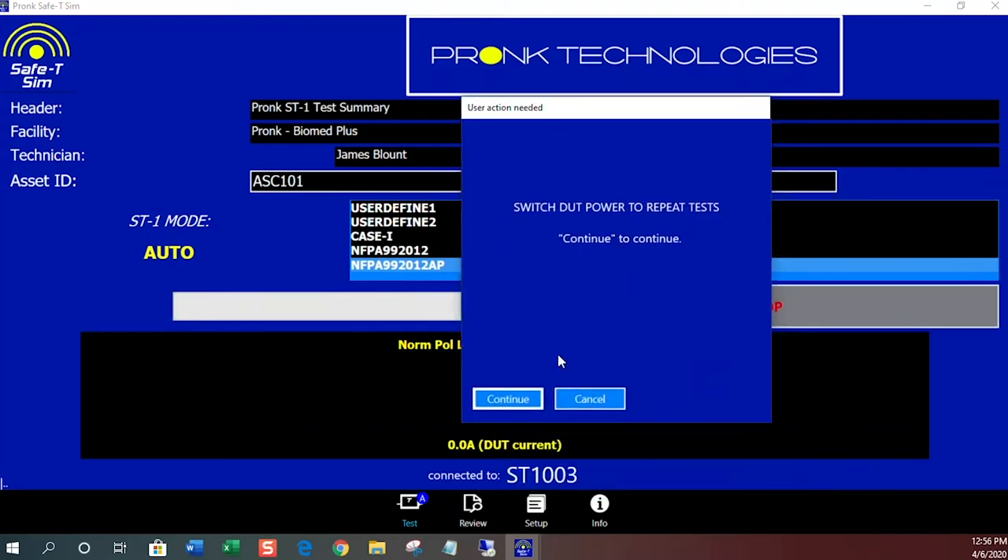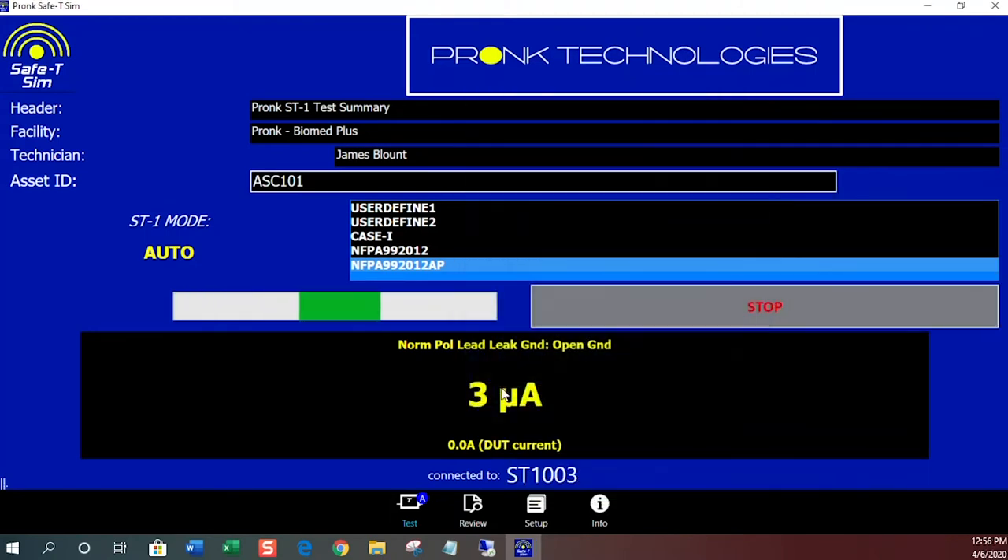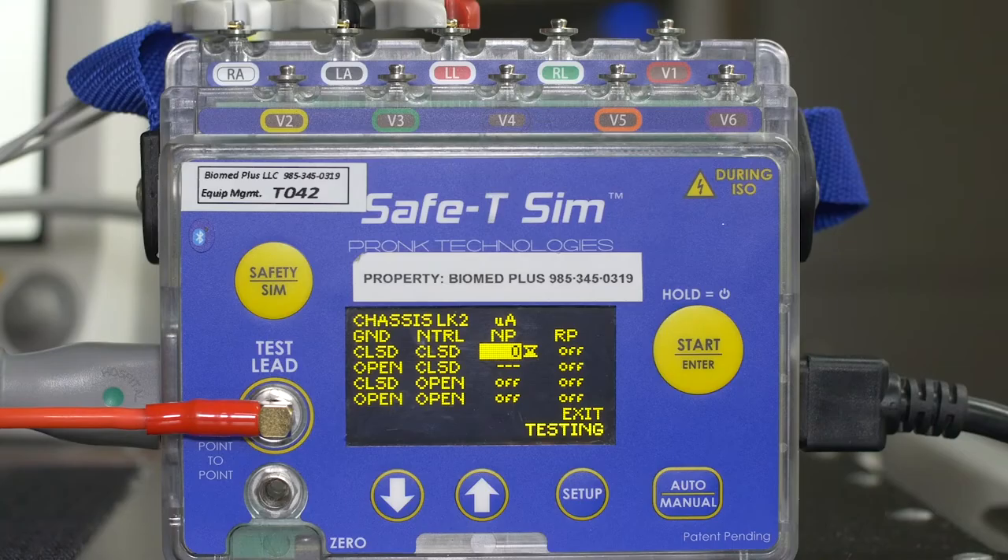A pop-up window will notify you when it's time to apply power to the device for the next round of tests with the power turned on.